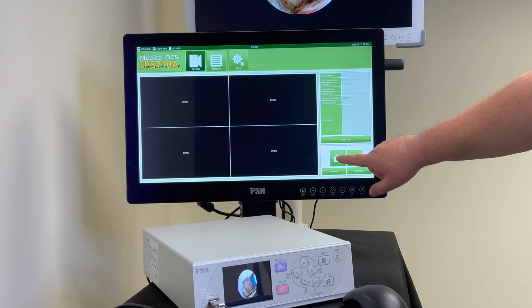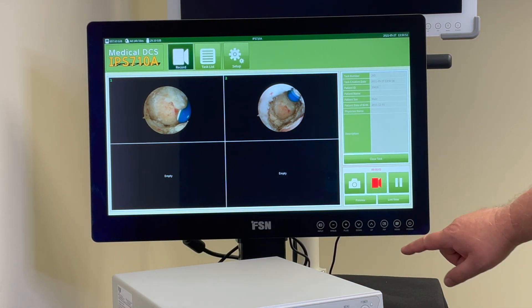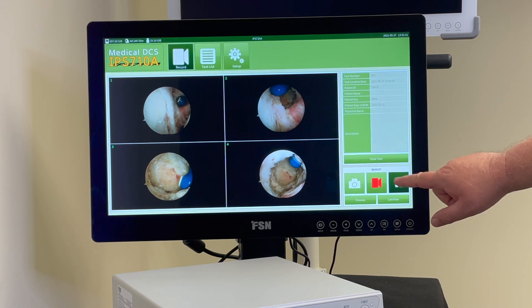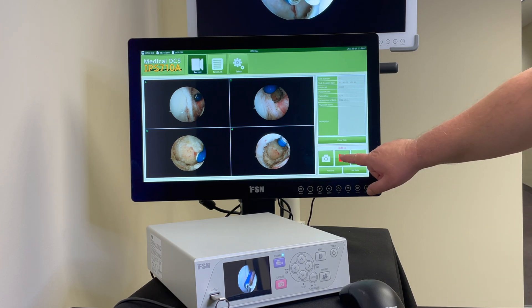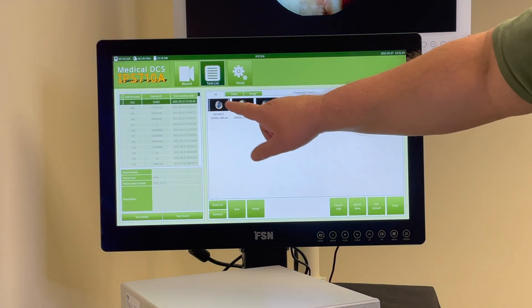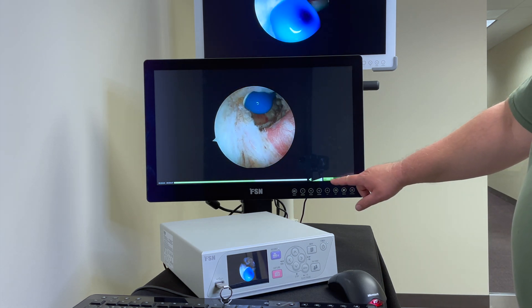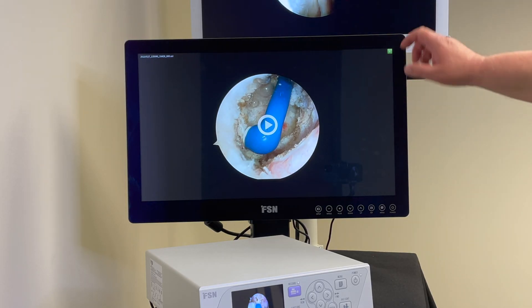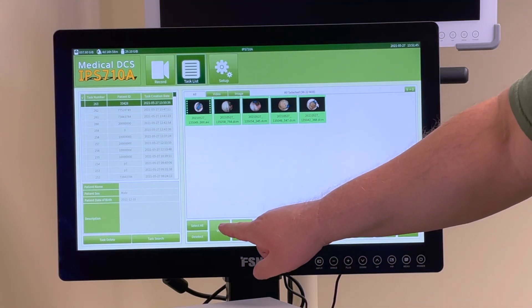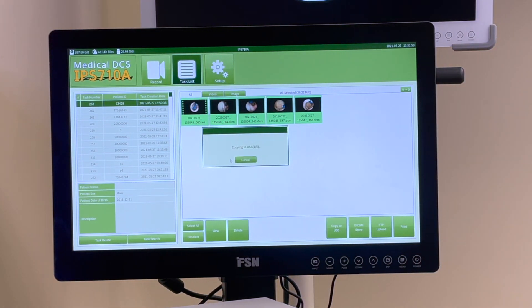Capture images anytime by tapping the camera icon. Record by pressing the video icon. In touch screen mode, one may press video to start recording. Press the pause button to resume recording, and press the video icon to stop recording. Close the task to finish the recording session. Tap Task List to view your recording sessions, then tap on the session of interest to view your media files. Select multiple files and choose options below like delete, view, or copy to USB, and confirm by selecting OK. The files will transfer to the USB stick to be used on a computer.